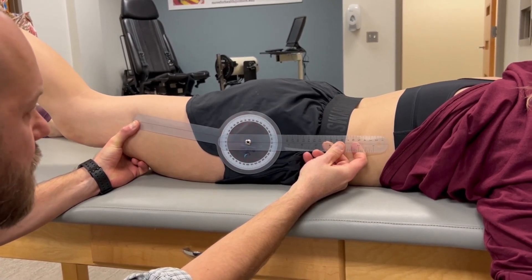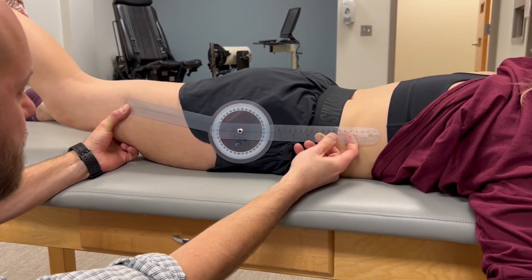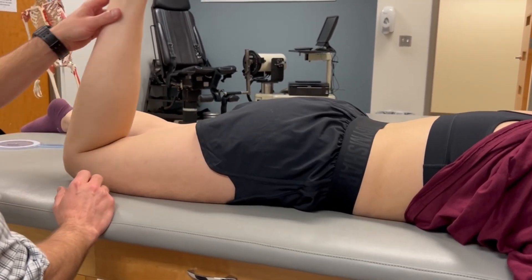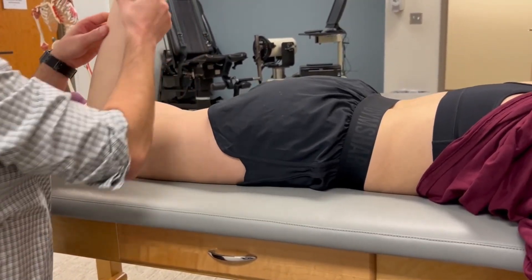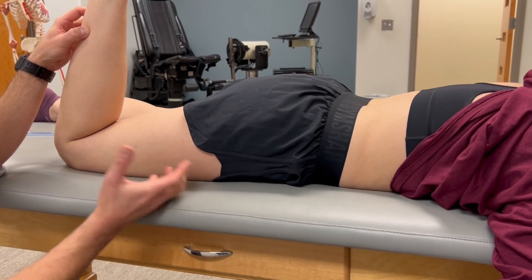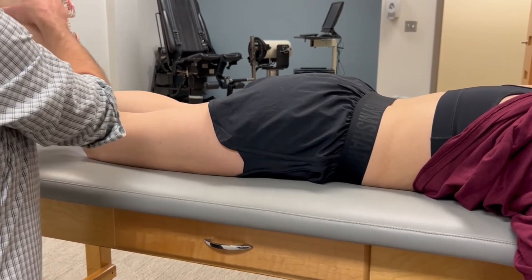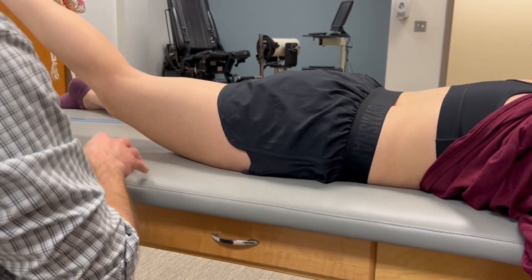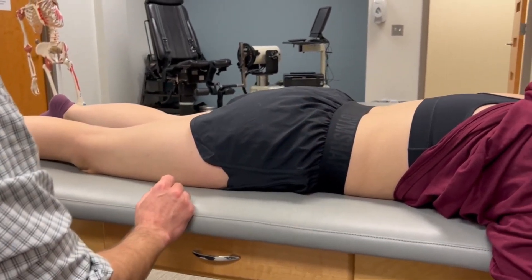Another key concept related to this measurement: when moving the hip into extension, make sure you don't have the knee flexed. If you flex the knee and then extend the hip, that becomes more of a muscle length test for the rectus femoris. We don't want adaptive shortening or restrictions in the rectus femoris to limit our true hip range of motion measurement. Make sure the knee is fully extended so the rectus femoris is on slack and not elongated across both the hip and the knee.